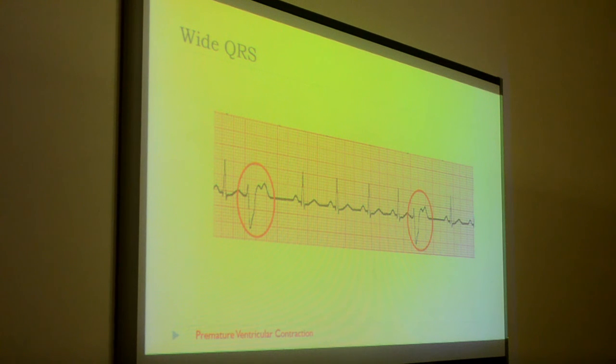There is an inverted beat, because again, this is probably coming, let's say, from the inferior right side and going up. Yes, it is inverted. If you compare it to this one, it is inverted. The axis is different here because it's not coming from top to bottom as it should be. It's maybe starting from the bottom and going in the reverse direction.